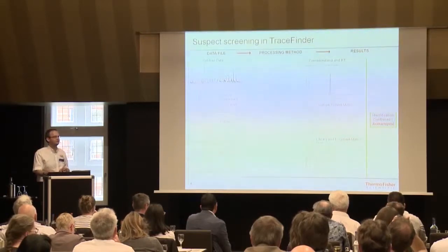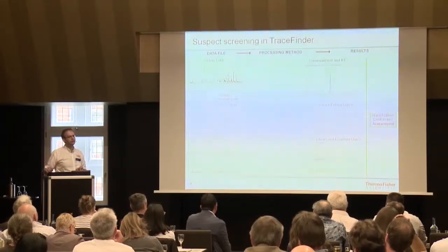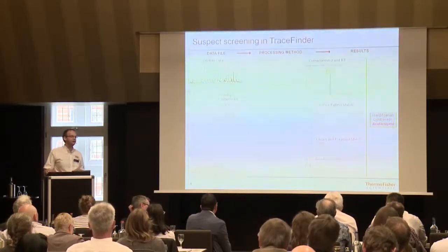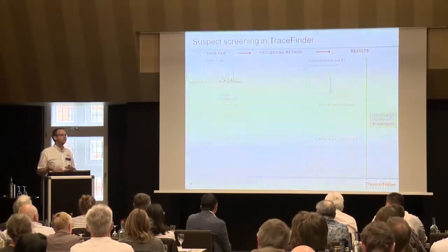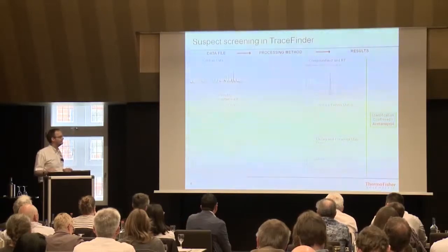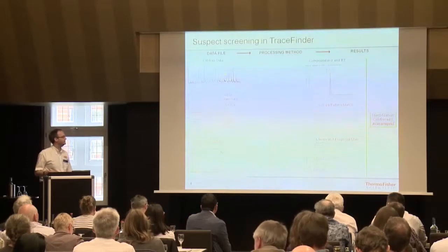Of course, all these things never can give the full answer without a qualified standard in the background. But at least this gives you a very good hint already. If you're not running standards for all the components, for the suspect screen, you never can run all the qualified standards. You cannot run 5,000 standards just for trial. But that gives you a very nice confirmation inside the software.